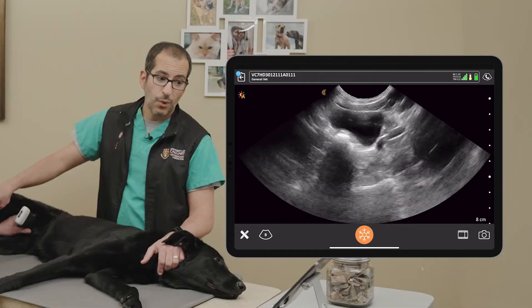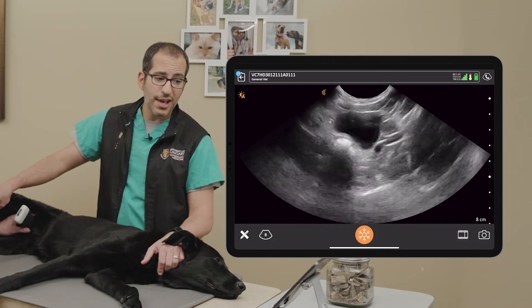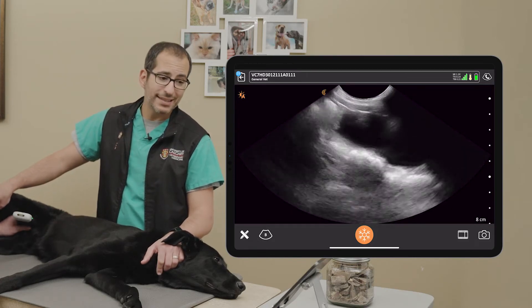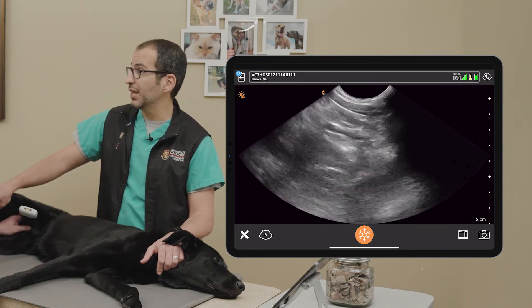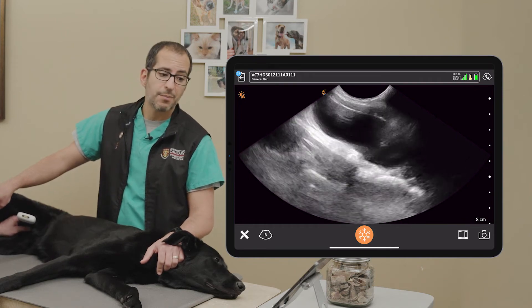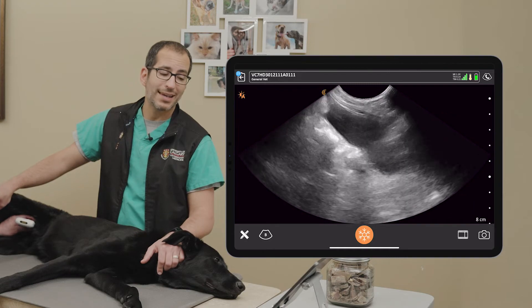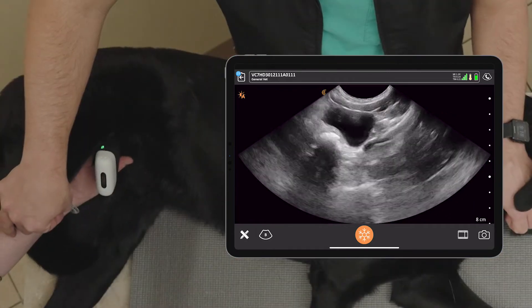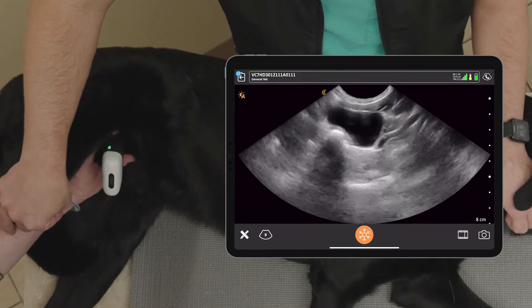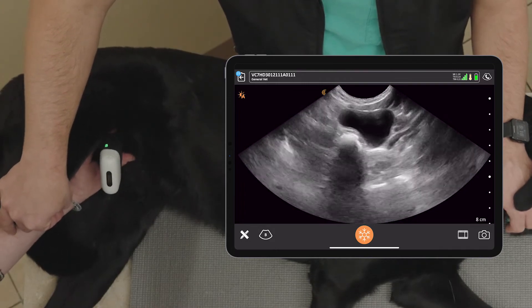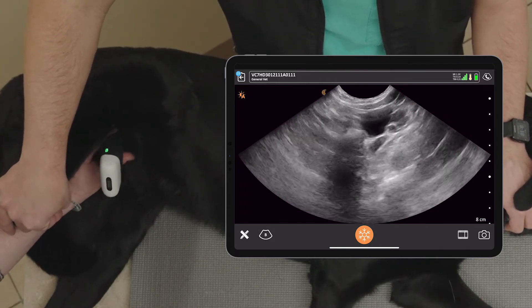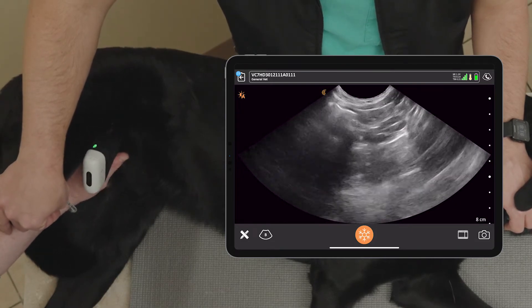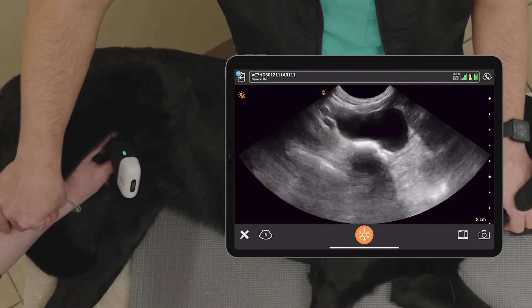What else can we look for at this site? Well, you can actually look for pyometra here. We're not going to go into the details of this because she is a spayed female so we won't be able to see the uterus. But you can actually detect pyometra in dogs that are potentially affected by this condition. We'll look distal to the urinary bladder — it's going to be dorsal that we're looking for that fluid-filled structure that is the uterus. You'll have to watch some of the lectures or podcasts on how to identify that for pathology, but that's where we would look for it.